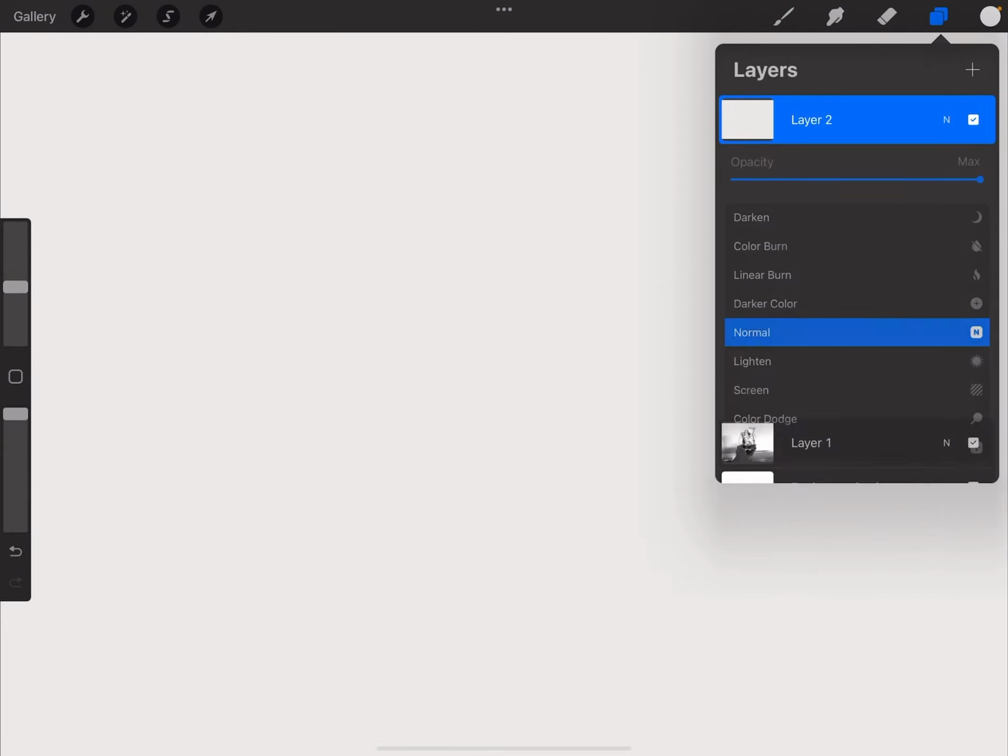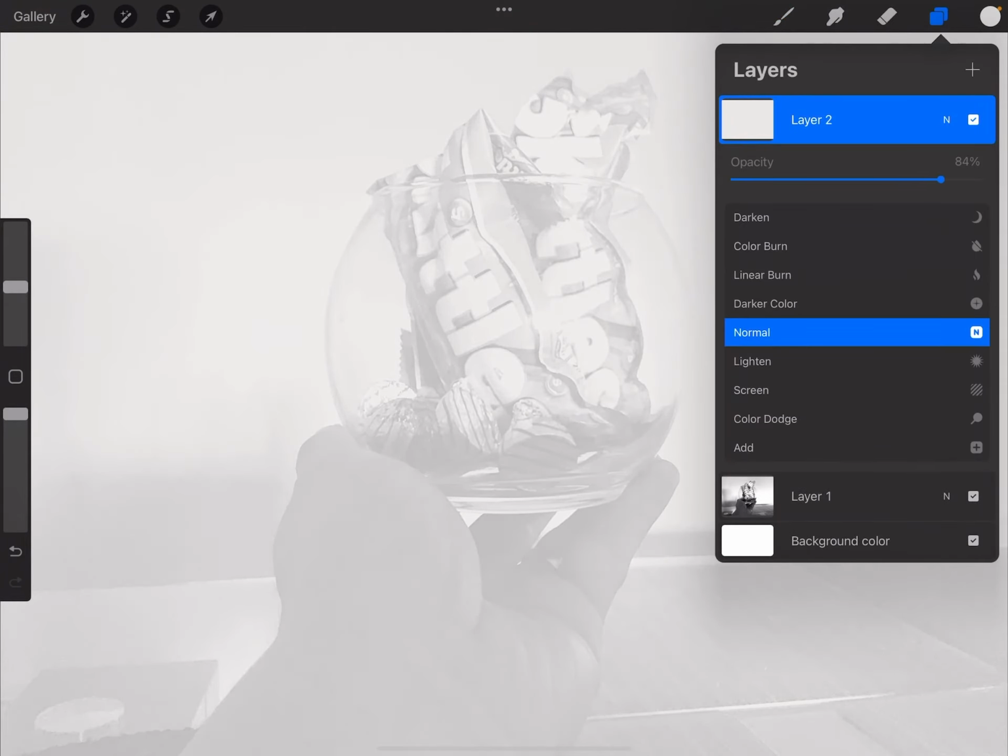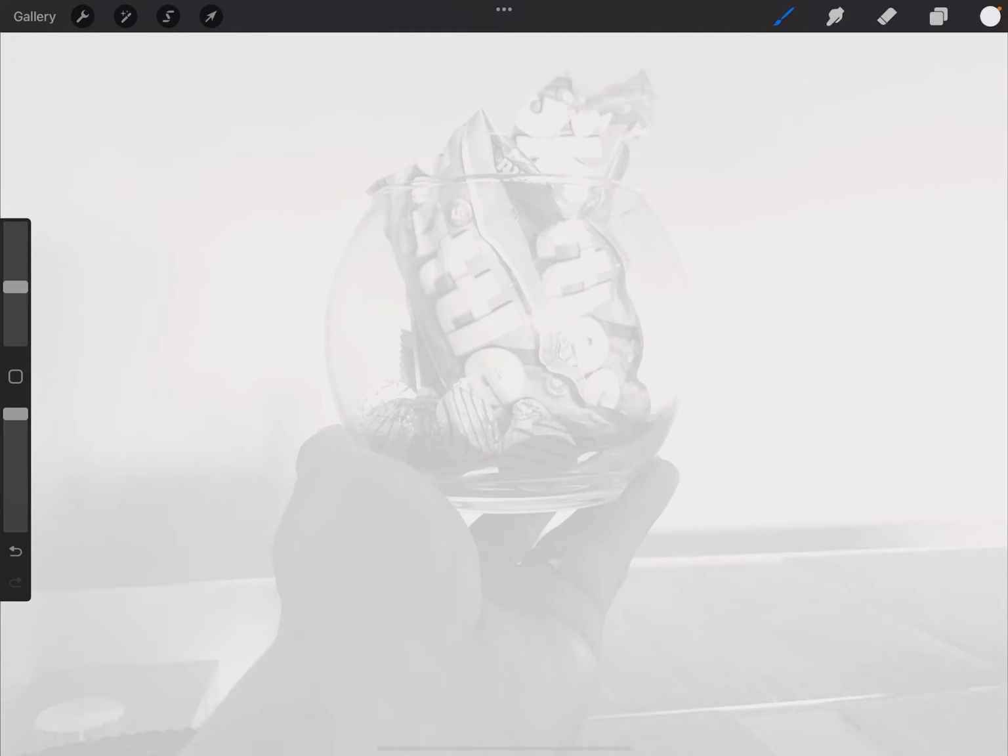It'd be kind of like this, right? This white layer that I've added on top resembles the scatter. As kVp increases, the scatter also increases. We end up with an image that looks like this, although it's got details on it. All the details are kind of fogged out by this white cover, which is the fog or the scatter.